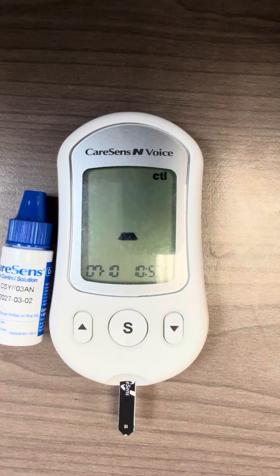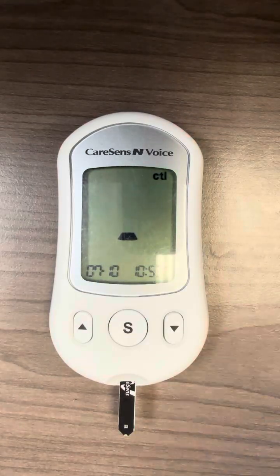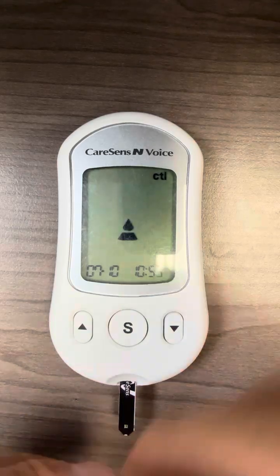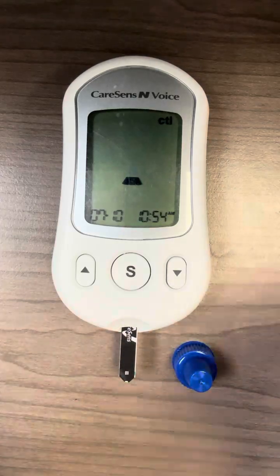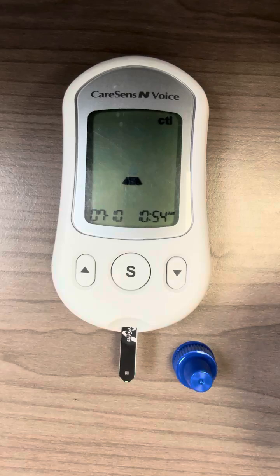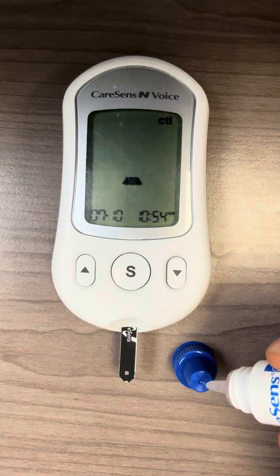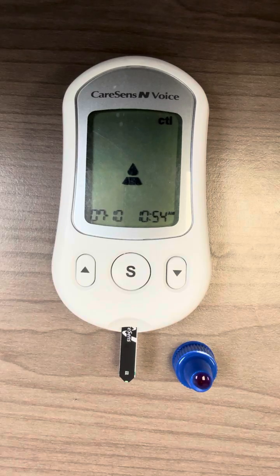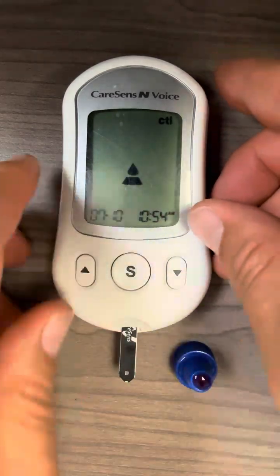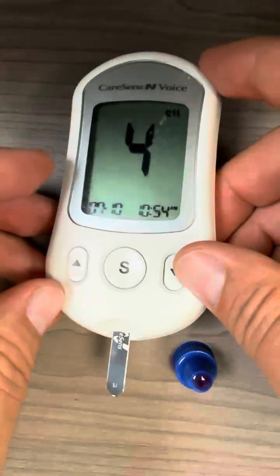The meter will now prompt you to apply control solution onto the test strip. From here, shake the control solution vial for at least up to five seconds or so. Then open the cap, throw away a couple drops onto a tissue, and then squeeze the control solution onto the top of the cap and lift the whole thing to dip into the control solution.